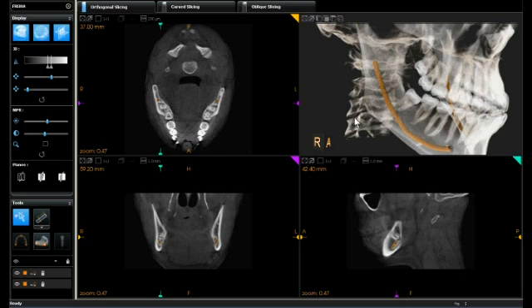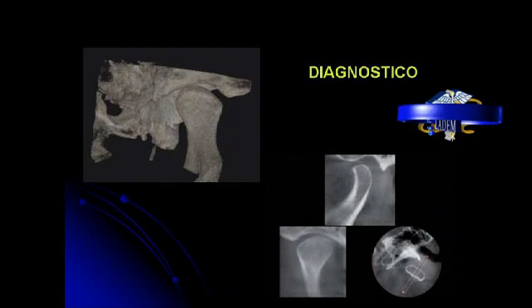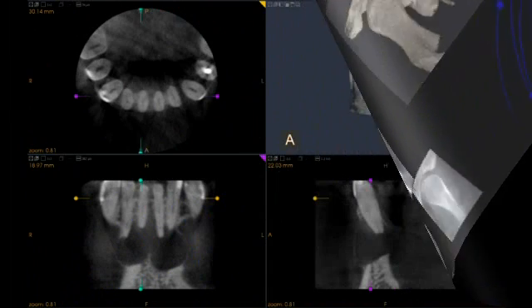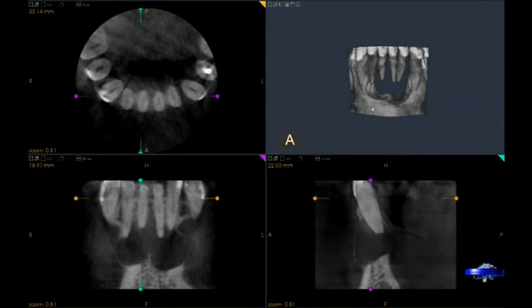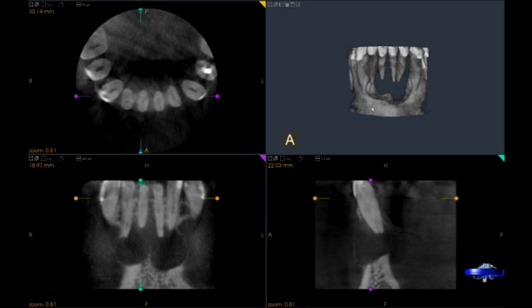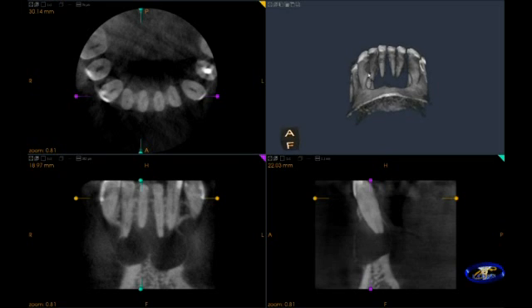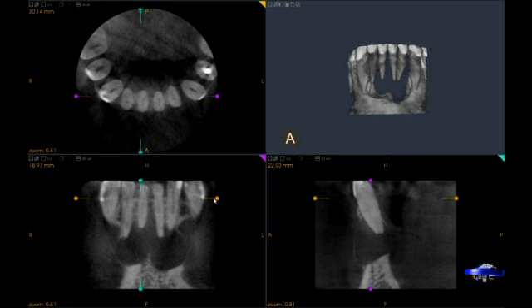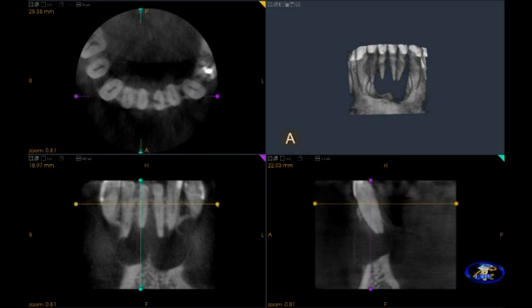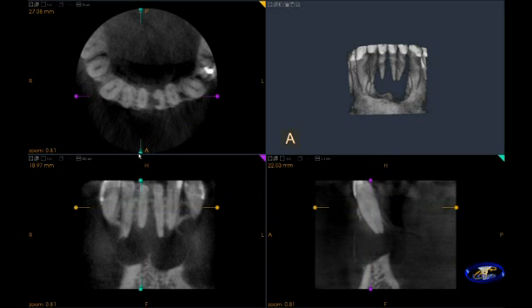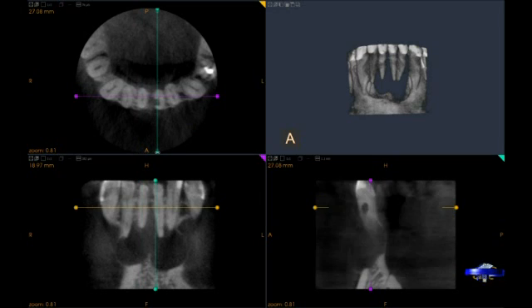This volume was acquired with the Kodak 9000 cone beam CT. The region of interest is the patient's mandibular incisor region. In the upper right you can see the volumetric view — we note a large cystic area. In the upper left we can see the axial view, the lower left the coronal view, and in the lower right the sagittal view.